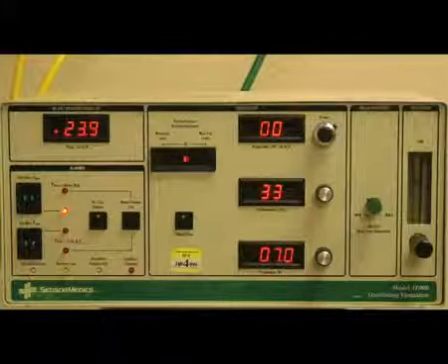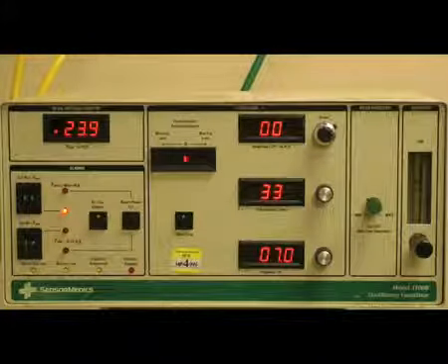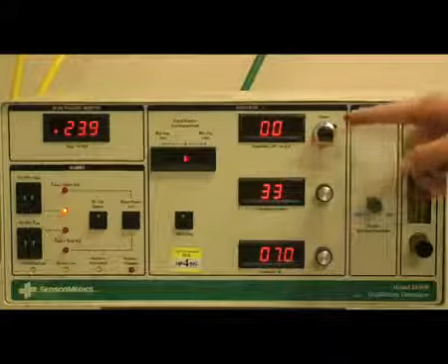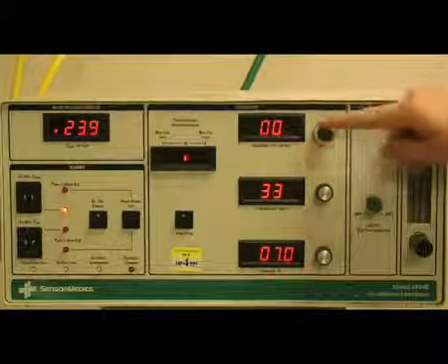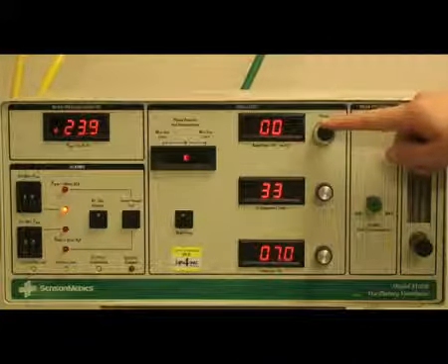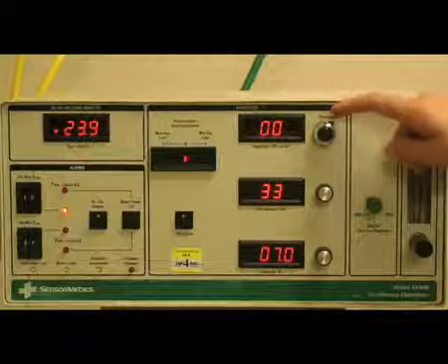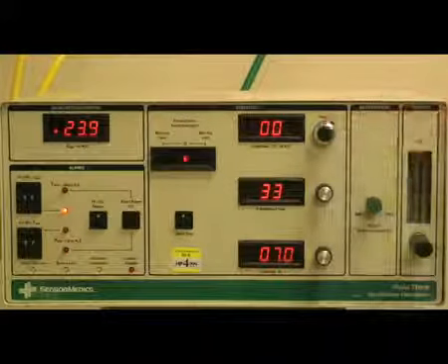When trying to affect a change in your acid-base status by either decreasing or increasing your pH, a secondary control for ventilation is your power, or delta P. The power is the setting that controls your change in pressure. As you increase your power, you'll increase your delta P, which can increase your ventilation, and of course vice versa. The lower your power, the more increase in CO2 will occur.